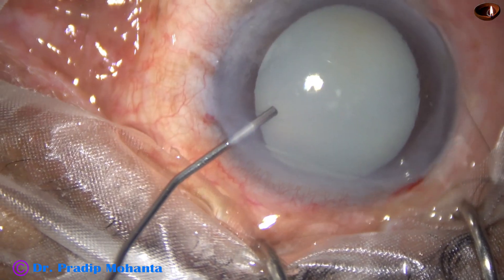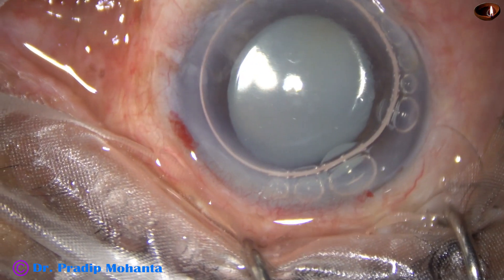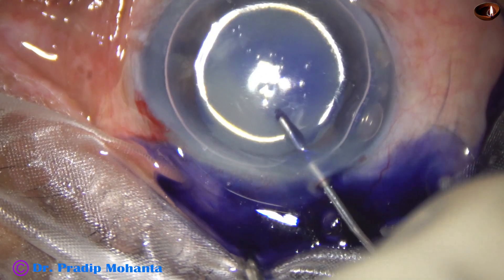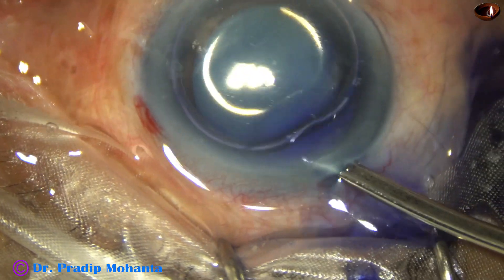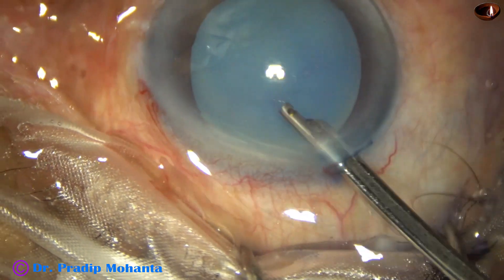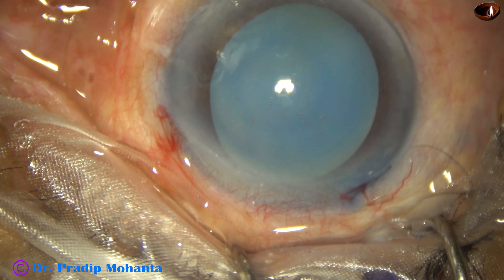First I inject an air bubble to fill out the anterior chamber, and then I inject the dye. Then I wash the dye out. This step I do because it looks clean to me.